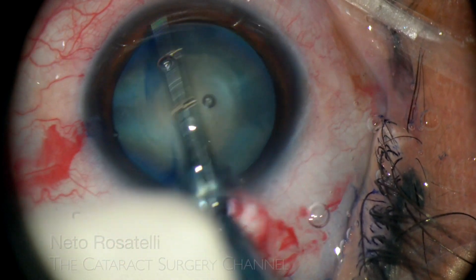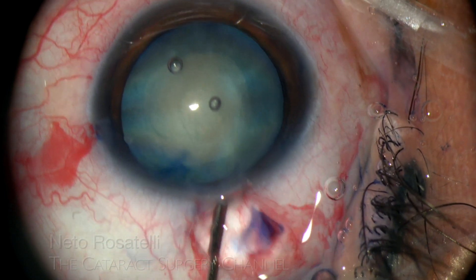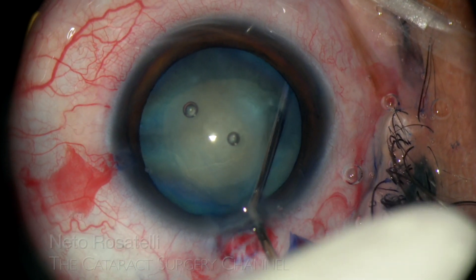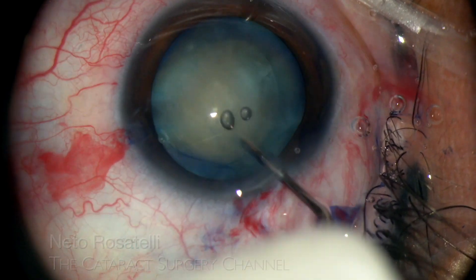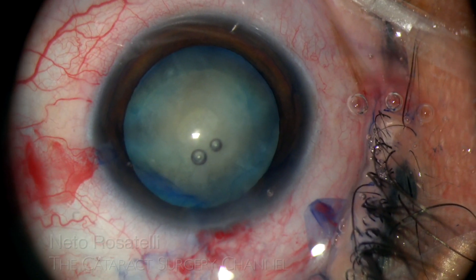Is this rhexis a small one? Since there is a significant amount of non-liquified cortex, hydrodissection is performed.